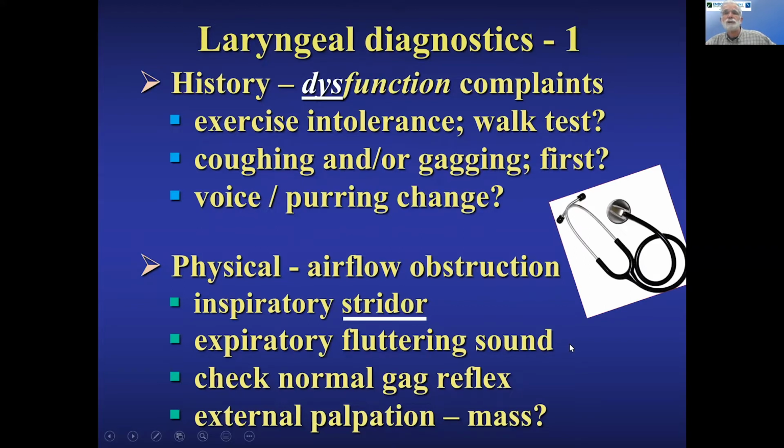On expiration, you may or may not have appreciated, there is a fluttering sound. I'll have a video and I'll have to make the sound when we see it. But the fluttering sound is the vocal cords, which are flaccid now, and on exhalation flutter, and they have a kind of guttural sound, type of sound that occurs. And on inspiration, the high pitch stridor.